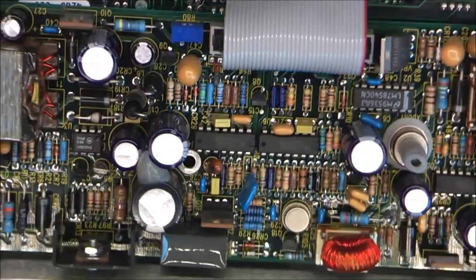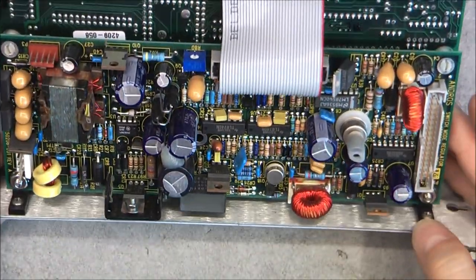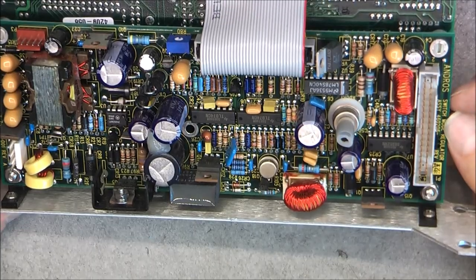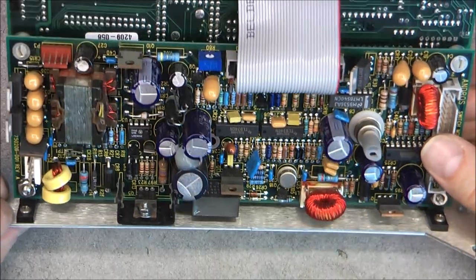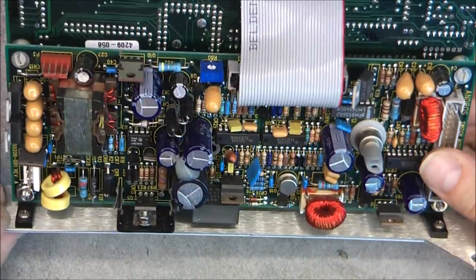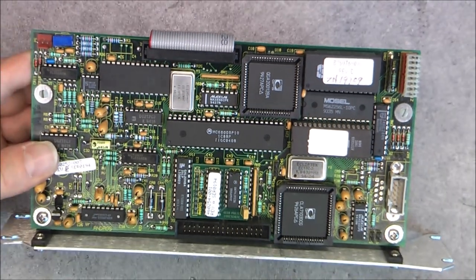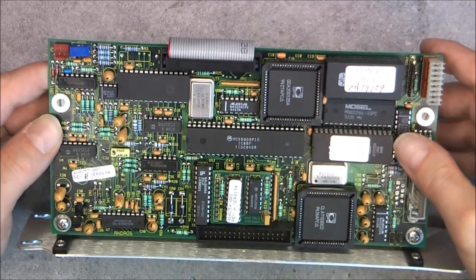Okay, we continue with the electronics, with the other PCBs. So this assembly, it is not written what it does. It is written Andros, switch mode regulator. So again, one more regulator. They were quite serious about power supply regulation in this thing, by the way. To power, apparently, this section. With two GPS brand ICs. It is the first time I see this brand.